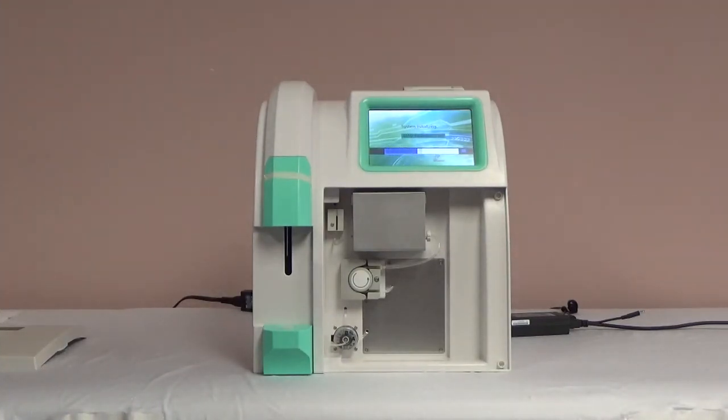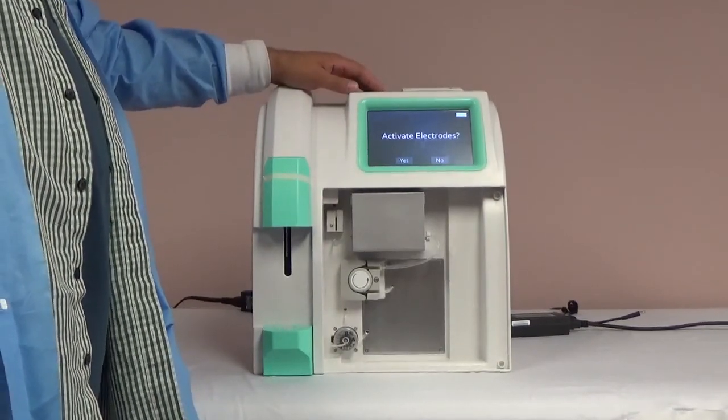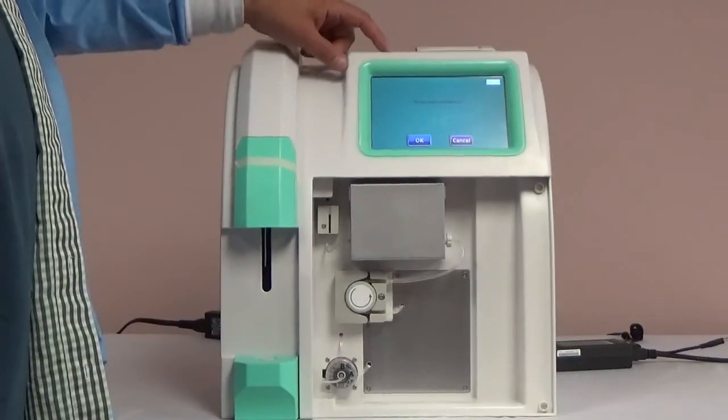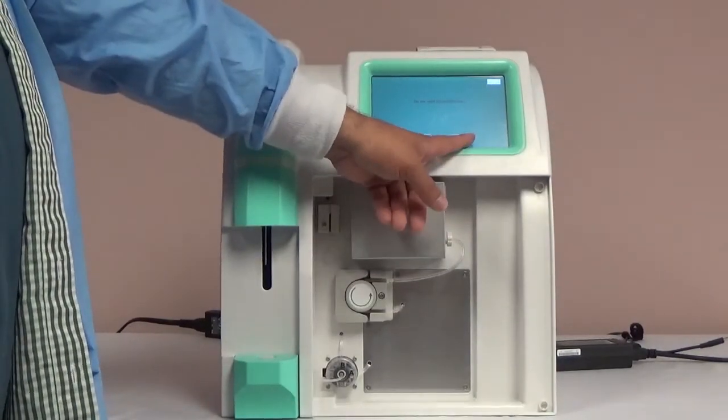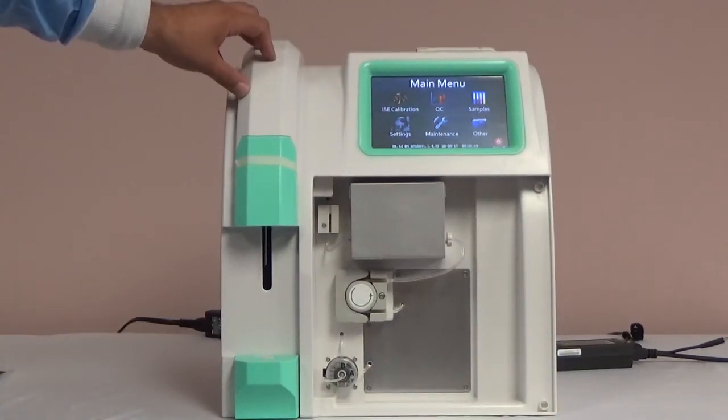It will check for and detect the pack. When the analyzer reads the pack, the first message will ask you to activate the electrodes. Before you activate the electrodes, you will need to prime the pack, so select no on the screen. When the analyzer prompts you to calibrate, hit cancel. This will bring you to the main menu. Select maintenance, then replace pack to prime it, then select OK.